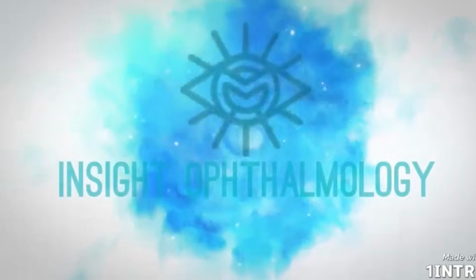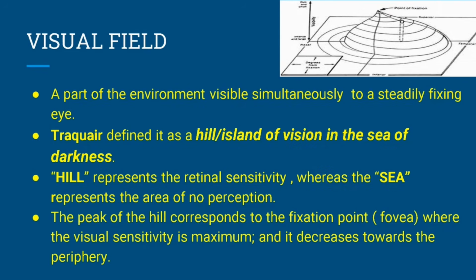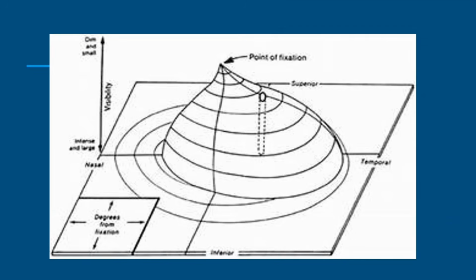The visual fields are defined as the part of the environment visible simultaneously to a steadily fixing eye. It is famously called the hill of vision in the sea of darkness, where the hill represents the area of retinal sensitivity and the sea represents the area of no perception. The peak of the hill corresponds to the area of maximum retinal sensitivity, that is the fovea, and it keeps on decreasing as we move towards the periphery.